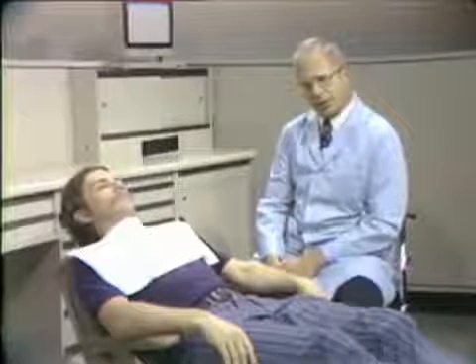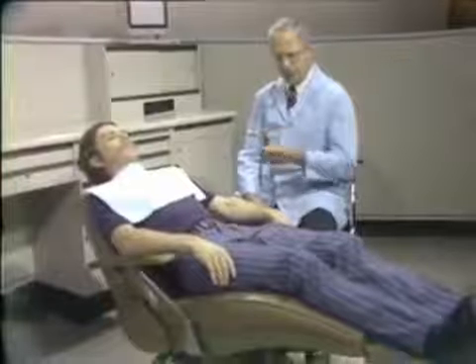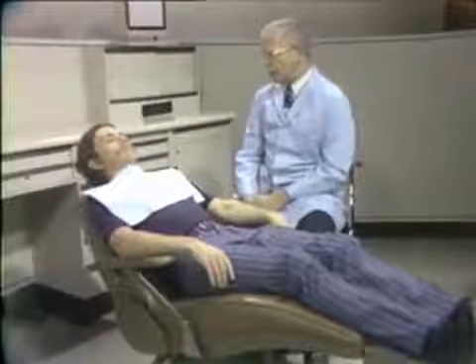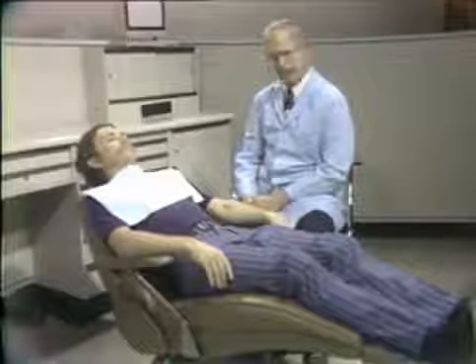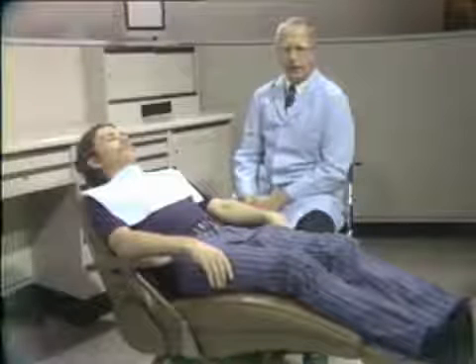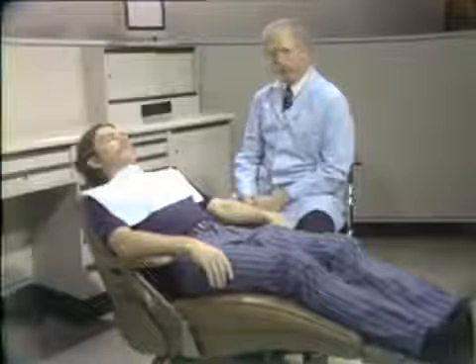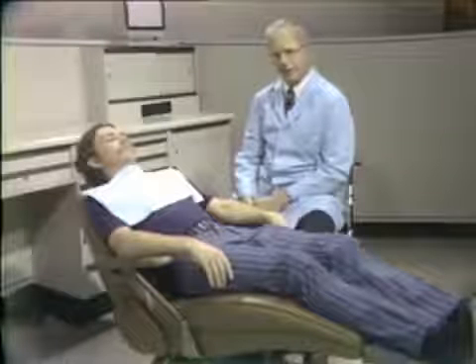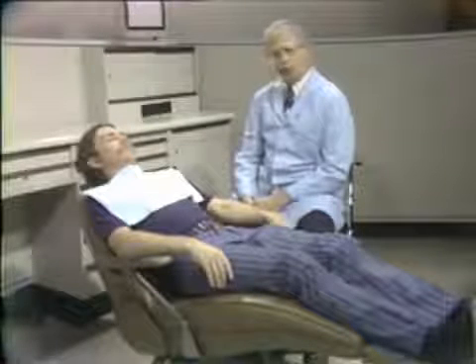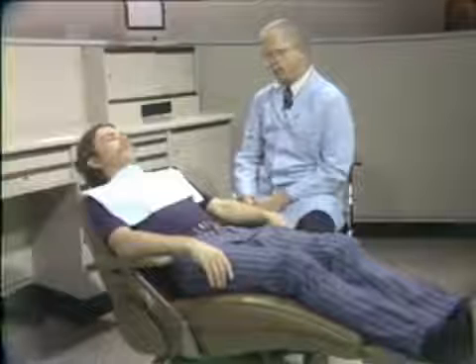First of all, I'd like to demonstrate proper patient position for you. We think about two different things when we think of patient position for a patient who's going to receive an anesthetic injection. First of all, as you've read before, the most common complication in local anesthesia is syncope or fainting, and we invite it when we have the patient sitting upright. So as you can see, we have the patient tipped back to at least 50 to 55 degrees from the vertical, and we'll avoid a lot of syncope and fainting. Secondly, this allows you to sit or stand comfortably and see adequately into the oral cavity for the various injections.